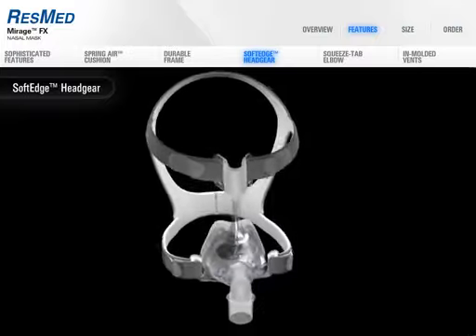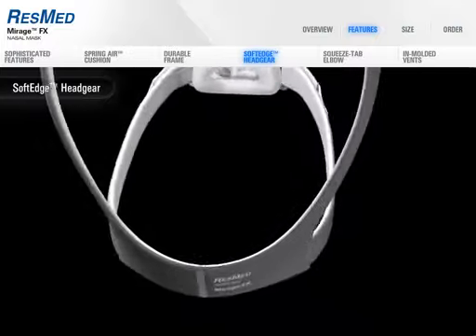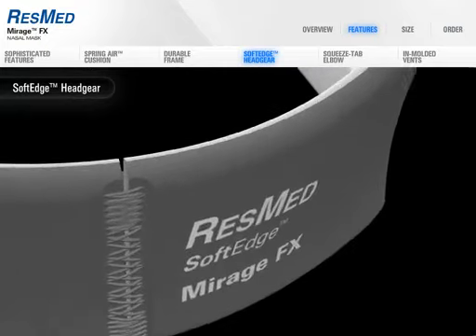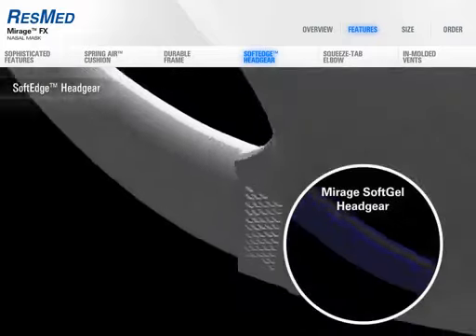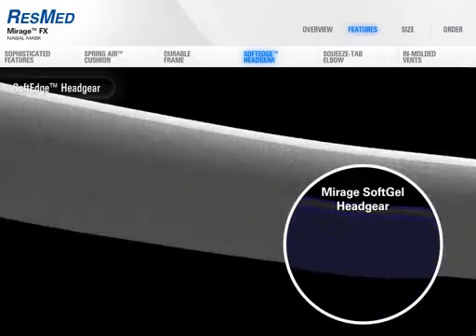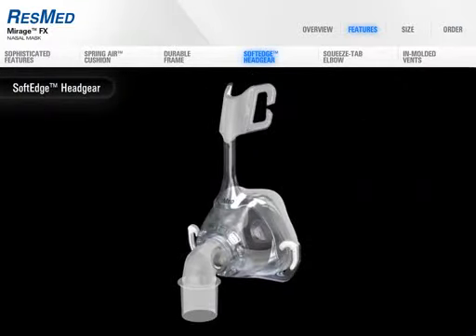ResMed has developed a unique textile composition especially for the Mirage FX headgear. The materials used are both flexible and breathable, improving comfort and support for users. The headgear's seamless soft edge is designed to reduce the amount of touch points on the face, in turn reducing the chances of marking on the skin.